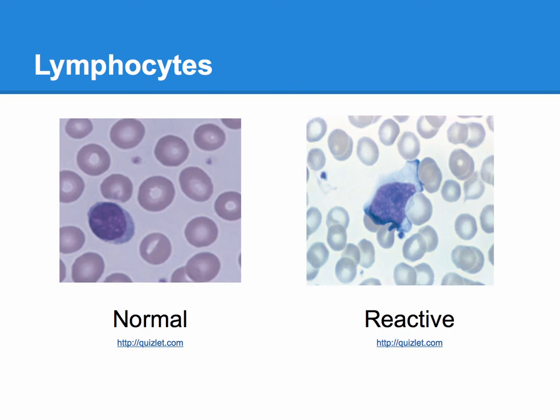Lymphocytes are the second most common leukocyte, with about 25 to 40 being found in every 100 leukocytes. A normal lymphocyte has a single lobed nucleus that is dark purple in a Wright-stained smear, and it is usually round, appears solid, and is generally smaller than other leukocytes. Little cytoplasm is left behind because the nucleus fills so much of it up. On the right is a reactive lymph, which appears to be stretched out similar to silly putty. Reactive lymphs are normal to find. Lymphocytes are important because they secrete toxic chemicals, and some are more directly involved with an immune response.